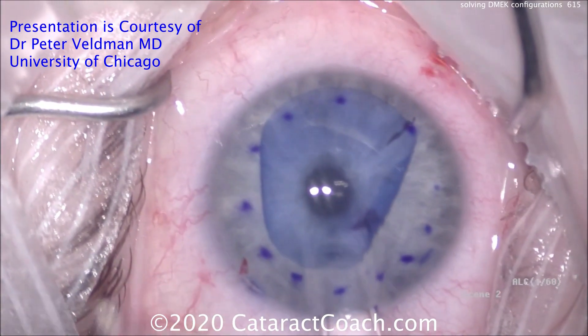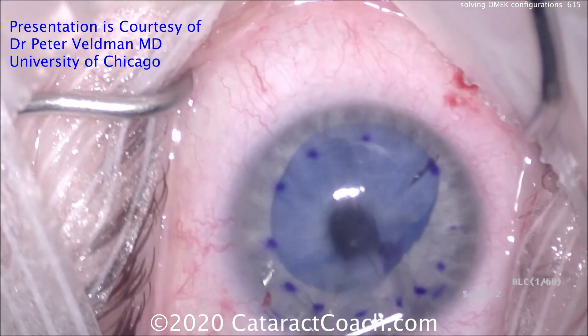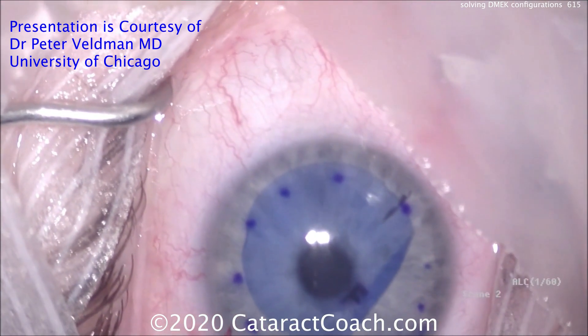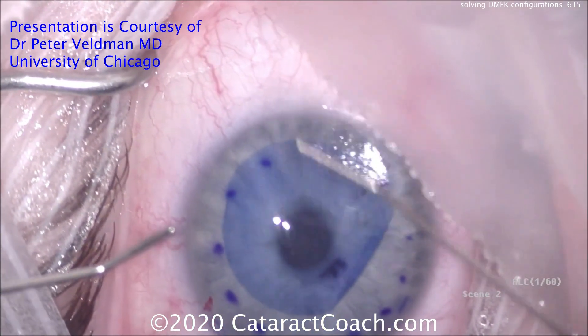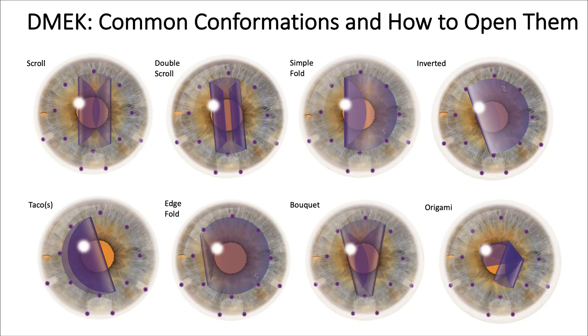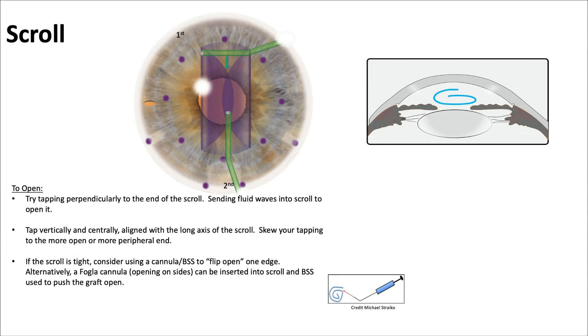The graft looks well centered. Slowly deflating the eye and removing the tube, with just a little left to unscroll — and it's done. Learning common graft configurations and how to open them is essential: the scroll, double scroll, simple fold, inverted, taco, edge fold, bouquet formation, and origami. Dr. Veldman provides explanations and videos for solving each.